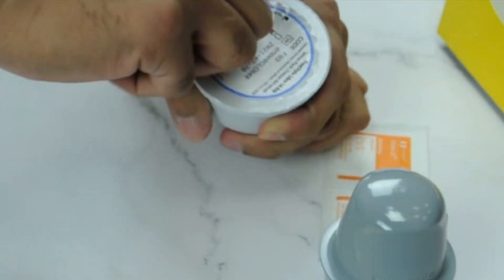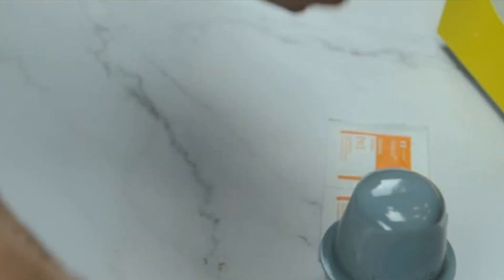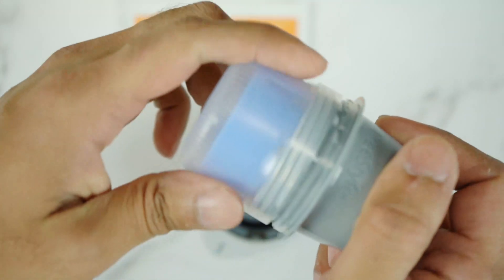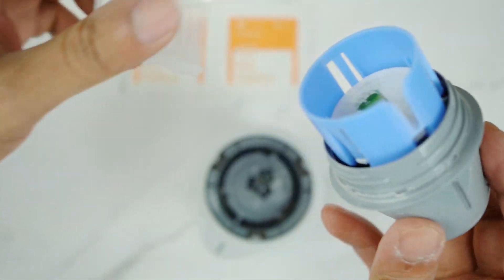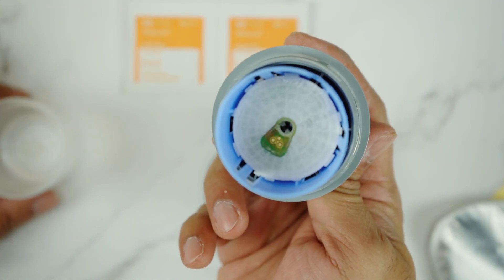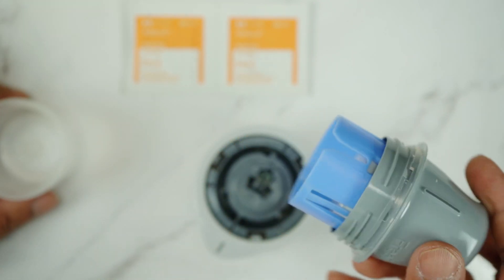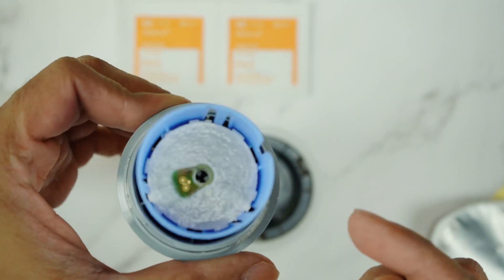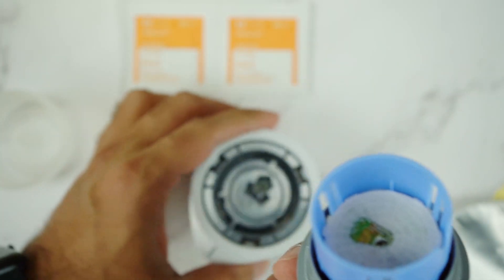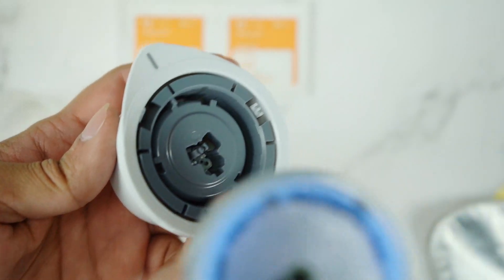So for this sensor, I will open it. Here is the applicator that needs to be twisted anti-clockwise. As you can see, there is a sensor inside — this is the sensor — and you'll see there is a groove right here.